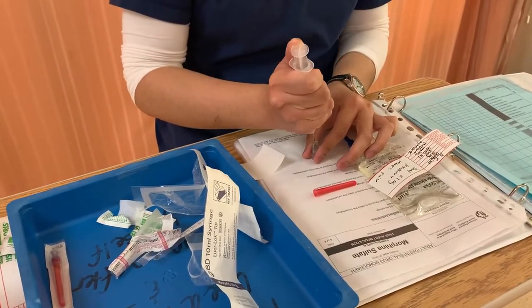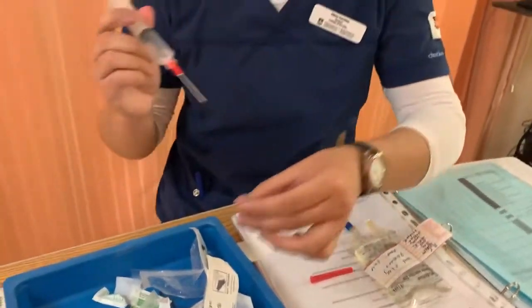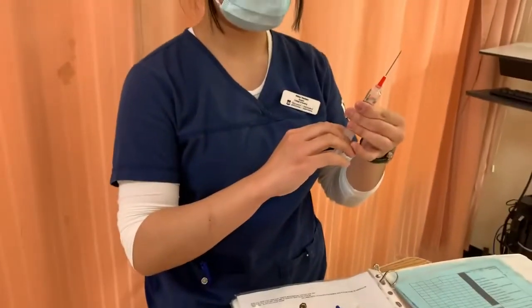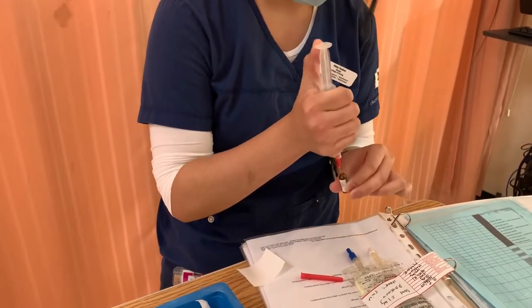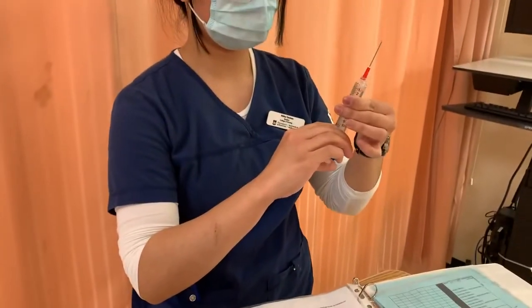Just gonna take that. And we're making sure that we're only touching the end part of the syringe, or the plunger, sorry, so that we're maintaining sterility as well. So I'm just gonna take that out. There we go. Just gonna take out the excess air.